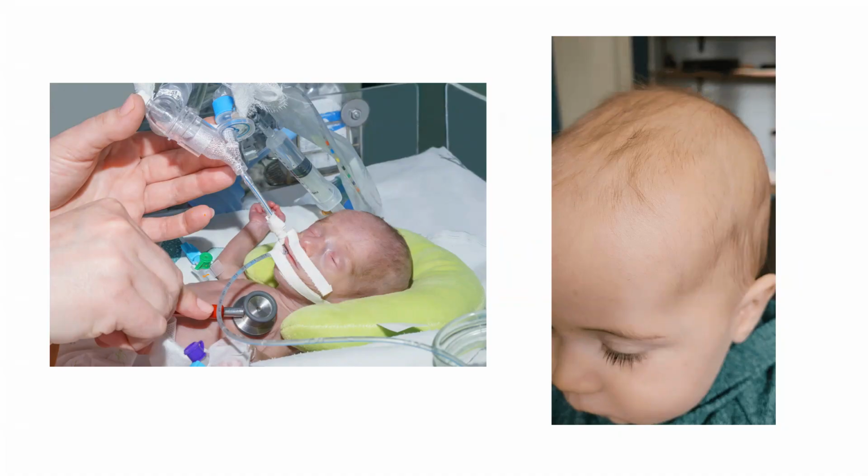Anybody? High frequency probe. Fuad, I'll need you to be a little bit louder. What are you going to use? A high frequency probe, yeah. Okay, so what frequency do you want to use? A frequency of 8. Okay, 8 and above. For a general scan, 8 to 10. Somebody said 10. Yes, 8 to 10. Okay, 8 to 10. So again, it's a good answer.